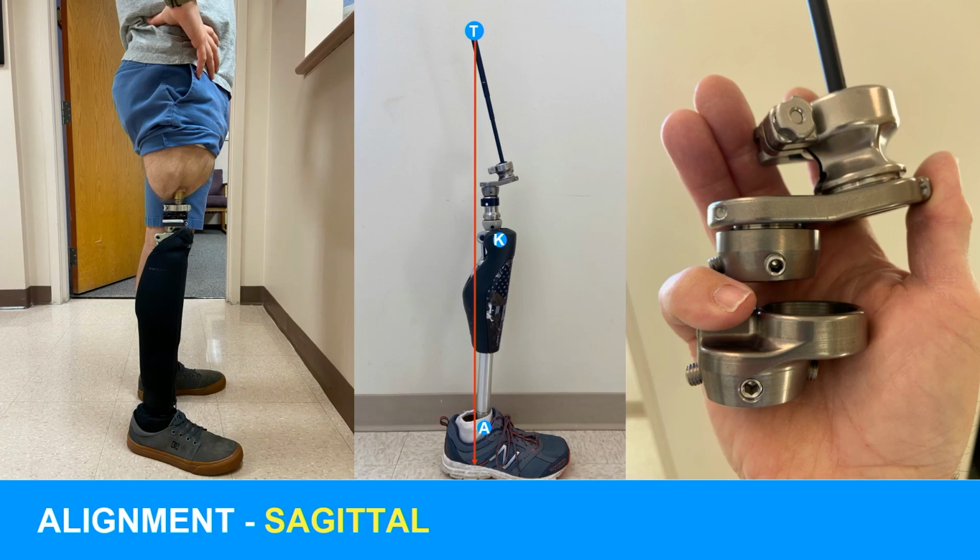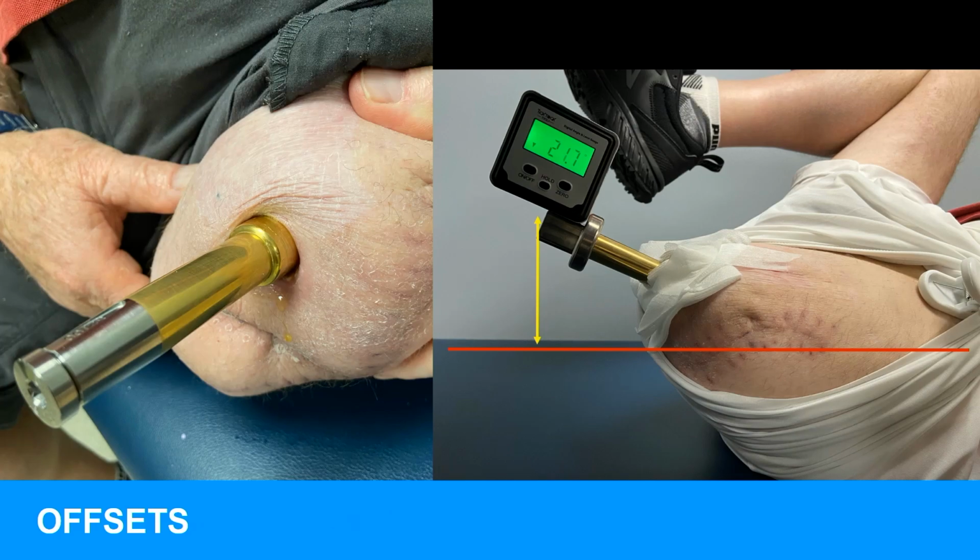And here are a couple examples on the right. We have different offsets from 0 to 20 to 40 to 60 millimeters. And here's a digital goniometer on the patient. A short residual limb. Don't forget the femur has anterior bowing to it. So a short residual limb with a 21-degree flexion contracture and a long dual cone.